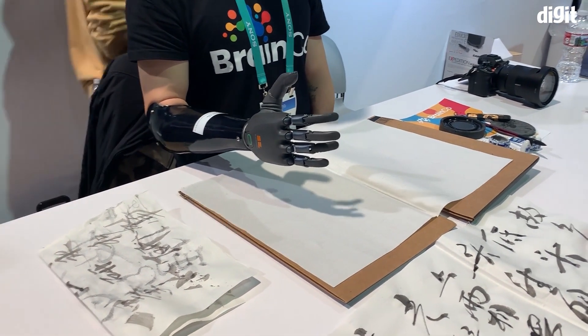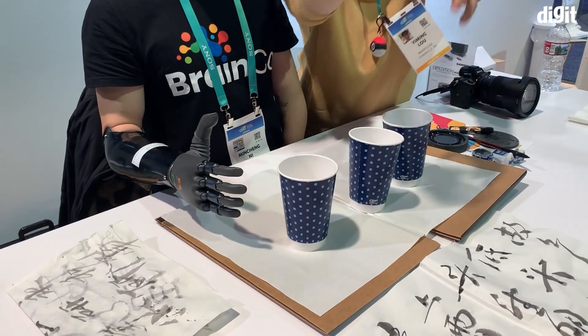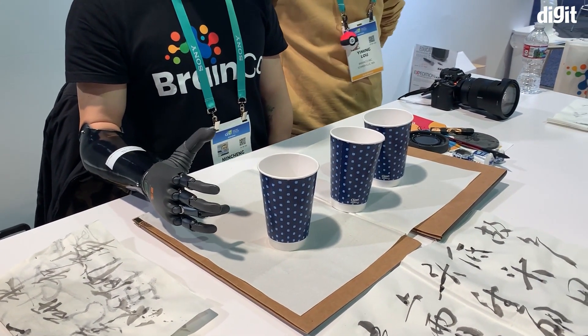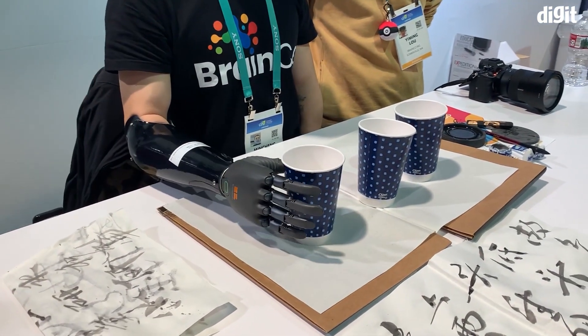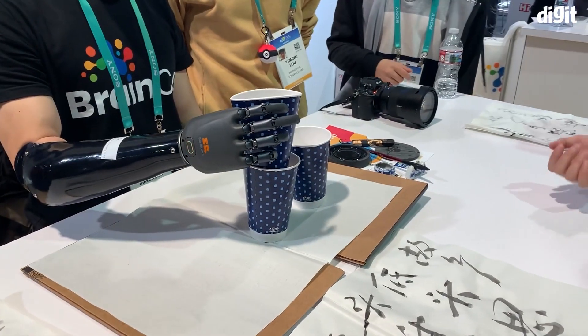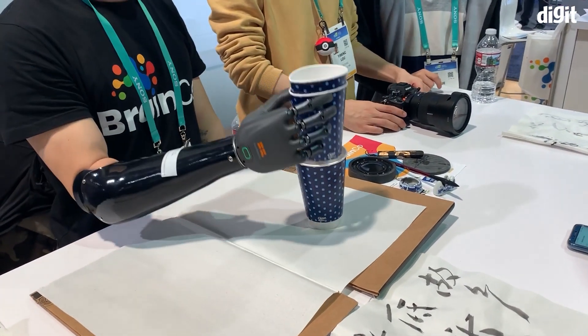It is almost instantaneous — the lag is just a few milliseconds between the intent. We are going to get a demo of the ability to lift a mug right now, enhancing the abilities of someone who has lost their forearm so they can actually take care of certain day-to-day tasks.